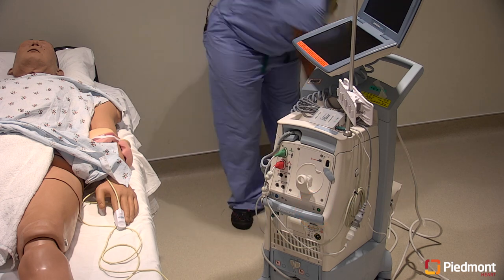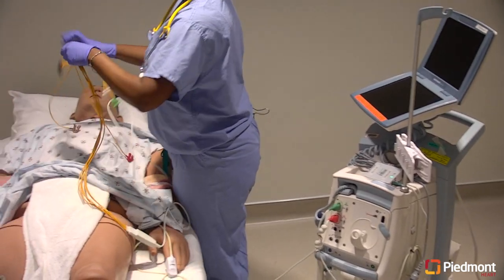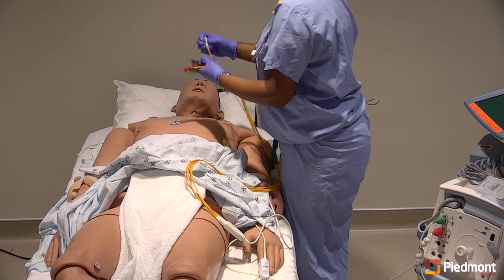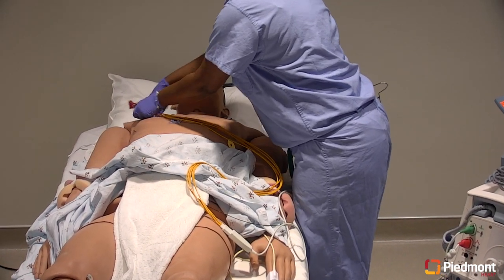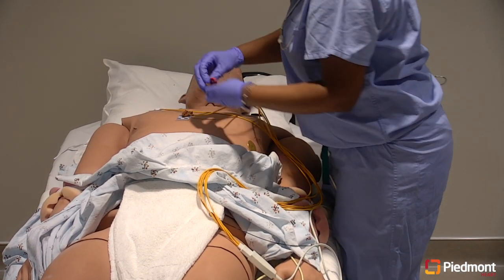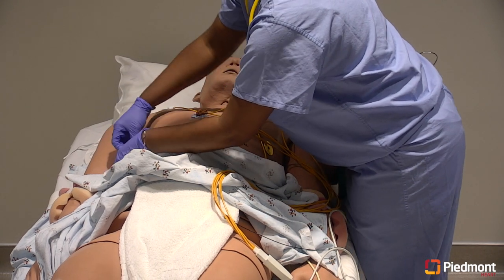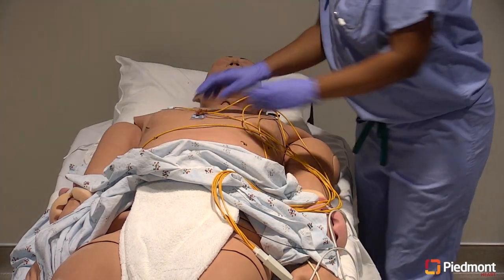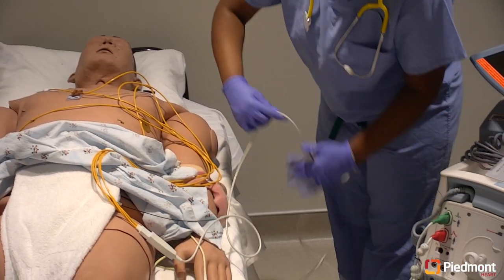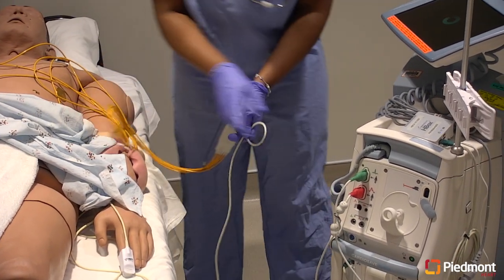Place the EKG monitoring leads on the patient as soon as possible. It is imperative that this be completed prior to the provider draping the patient and preparing the sterile field, as you will then be unable to access the chest of the patient. Proper lead placement is key. Ensure the EKG leads are connected to the console.